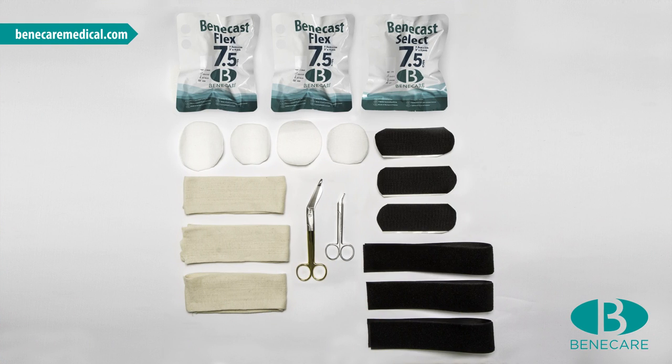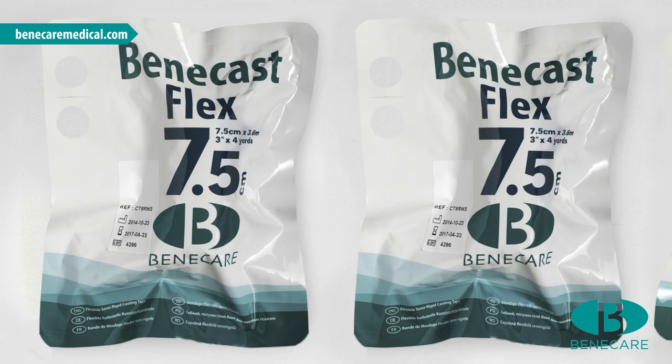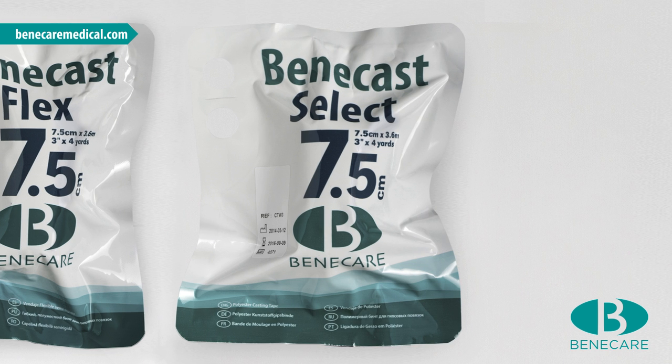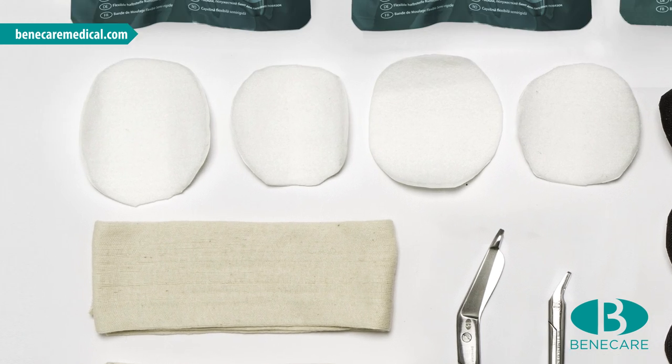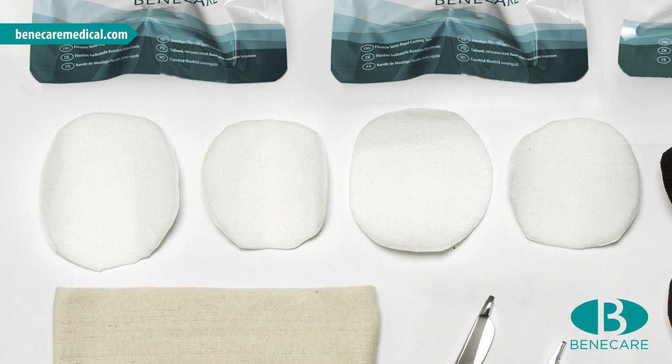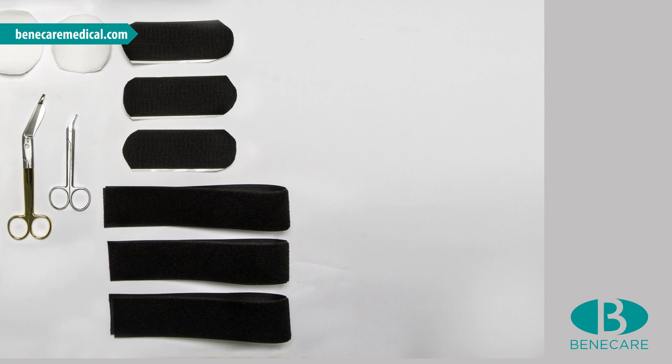The materials required for a below-knee combi-cast are 2 rolls of 7.5cm Benecast Flex, 1 roll of 7.5cm Benecast Select Polyester, 3 pieces of Benecare Stockinette, 2-3mm adhesive felt for the negative padding, and 3 pieces of 50mm Benecast Hook and Loop.